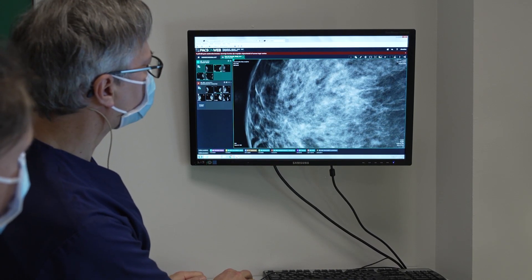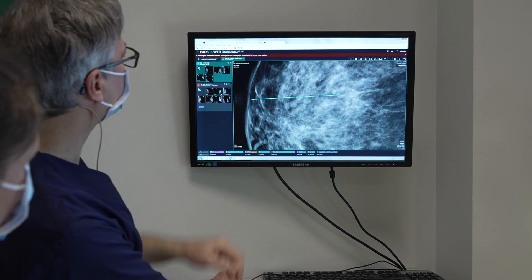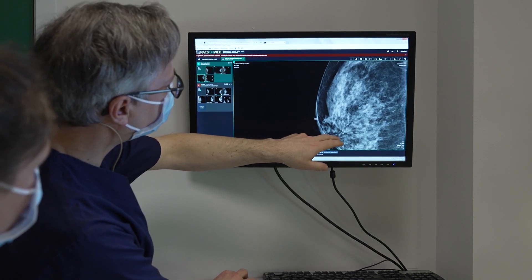Before starting the biopsy, we measure the distance from the microcalcs to the nipple on both the craniocaudal and the oblique view. In our case, respectively 4 and 5 centimetres.